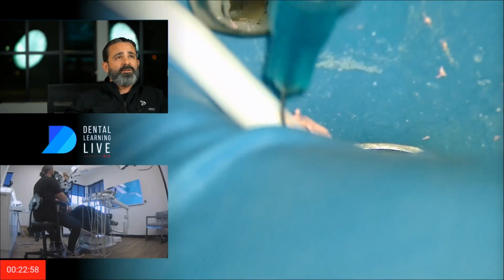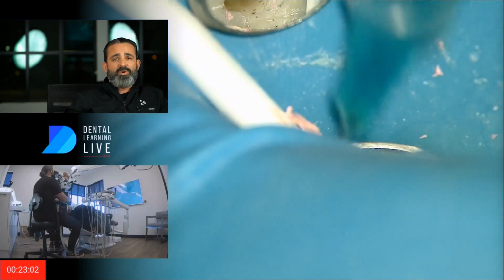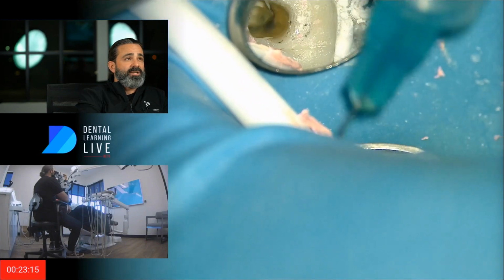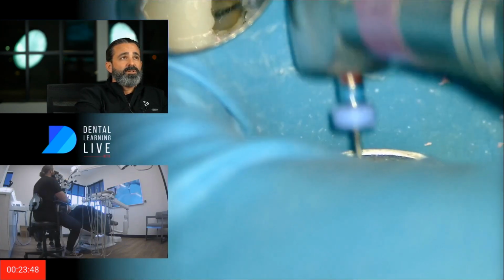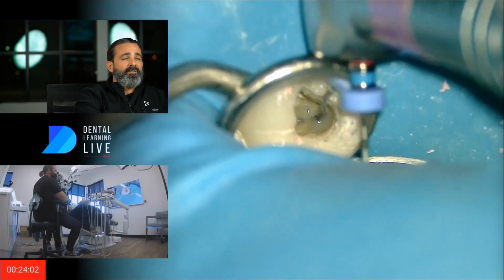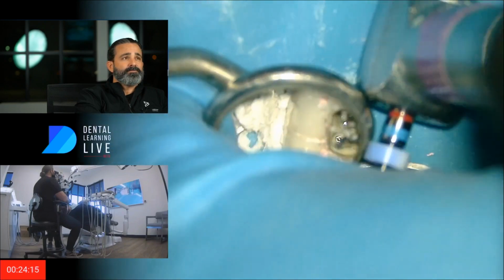Kind of off screen a little bit because I'm just dancing with it, so it's hard to show that in the mirror. But I'm just wicking it, I'm getting it soft, and we're going to keep playing this game until I get it out. Sometimes this can be the longest part of the job. And at that point, I went back to a 3D shaper after I had danced with it enough to where I felt like it came off the wall.